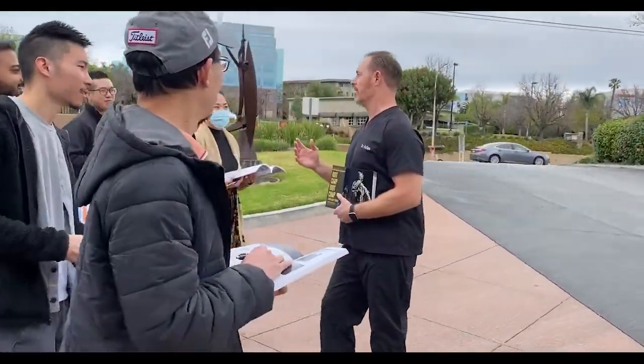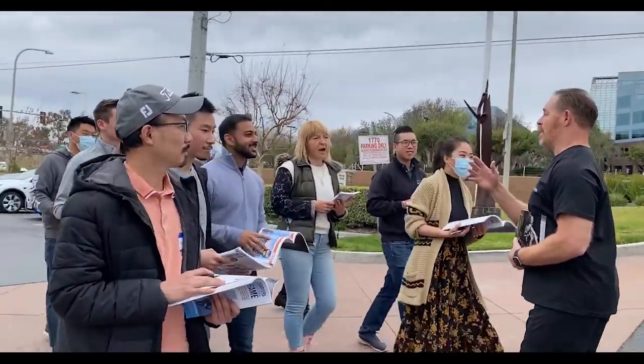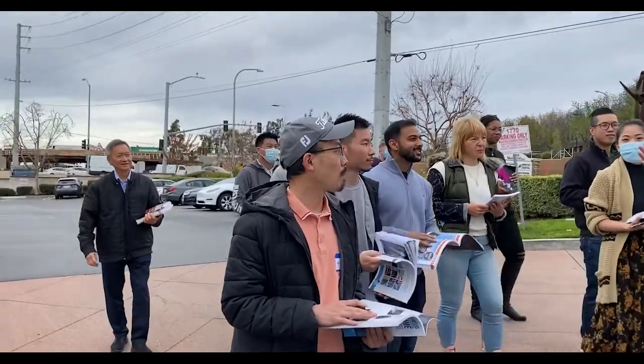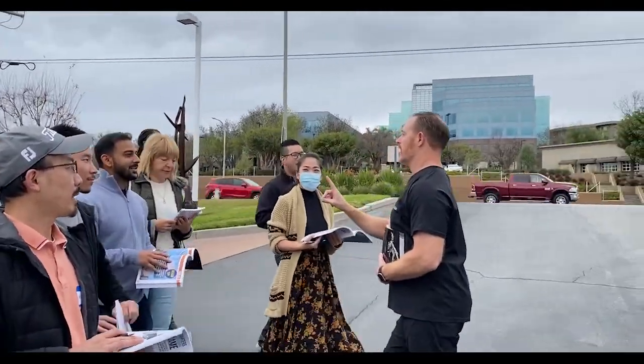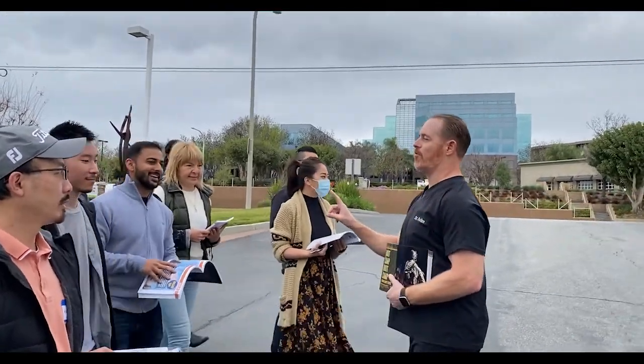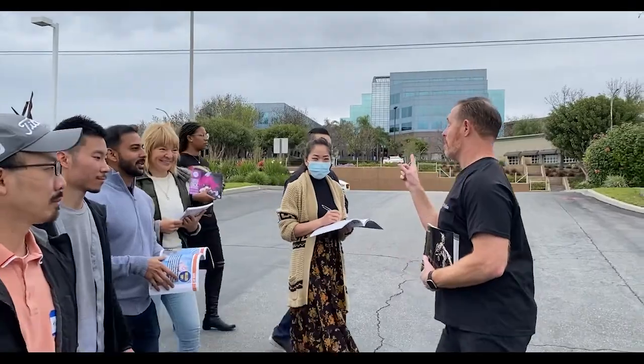You skipped a step. What's after our, we do coronal flare, maybe middle flare, right? Okay. Then what's the next step after that? Negotiate to patency with what file? With 10K file. 10K, 25. Then what? Make it loose. Then we go back to prepping the canals.